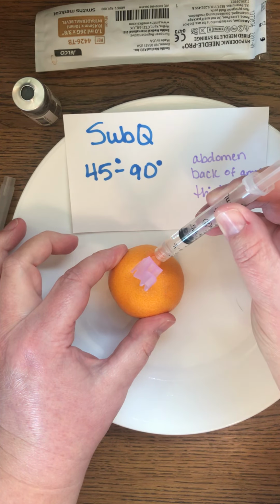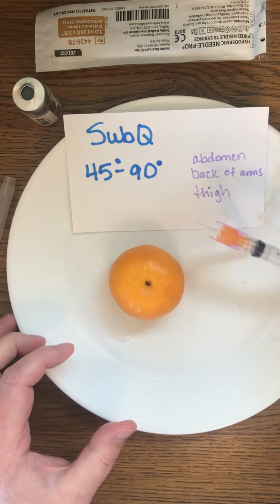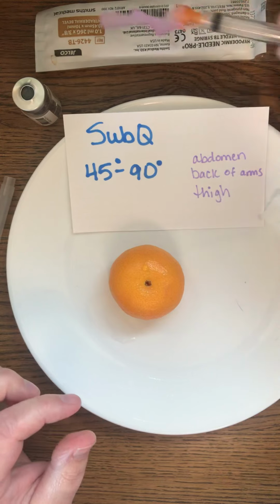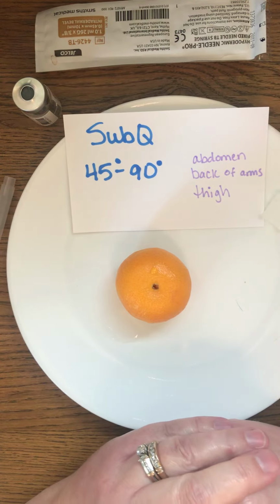Once you're in, you can stabilize, and go ahead and push your solution in, and then you'll go out, and right away you're going to activate your safety device. Okay, all the way. Again, obviously, you're going to let it click into place. I'm not going to for this video, though. And that's how you give a subcutaneous injection.